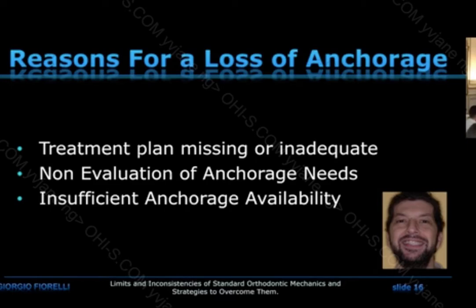And this happens. TADs are not perfect. So I'm going to show you a case of this kind. This is a case of mine. This is Ricardo.